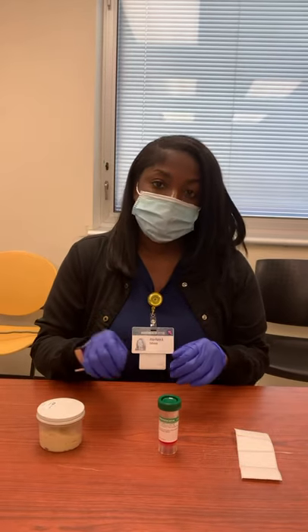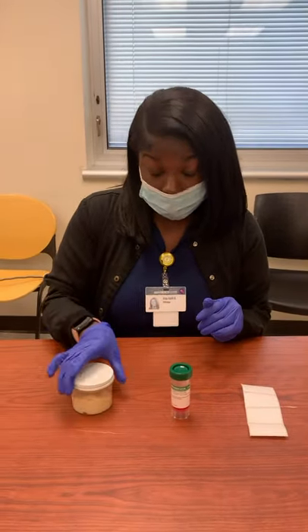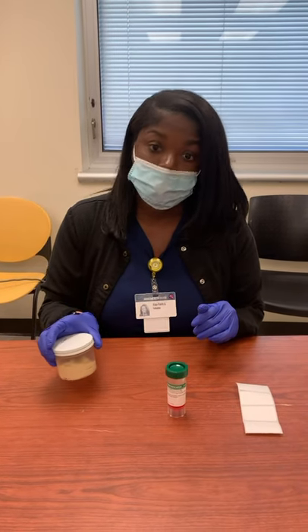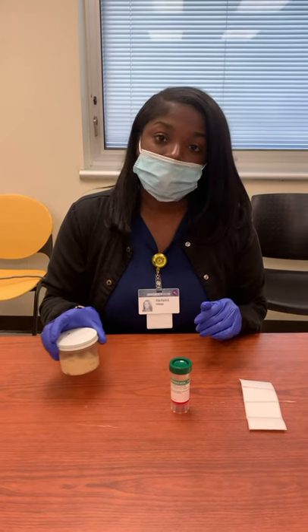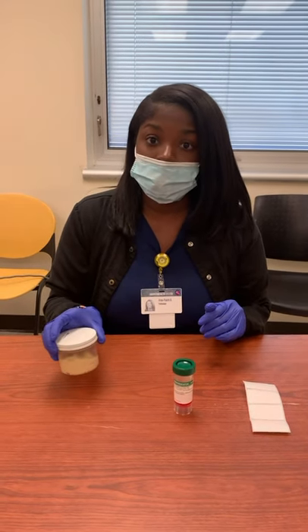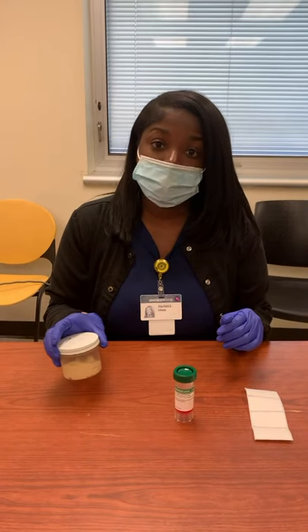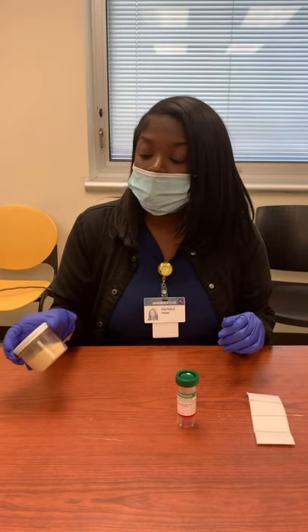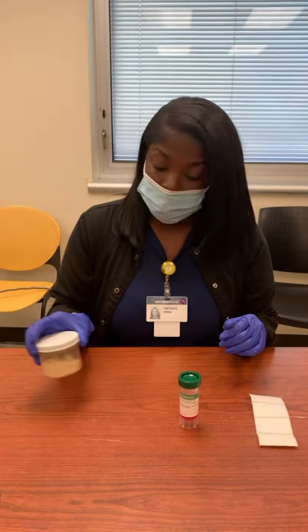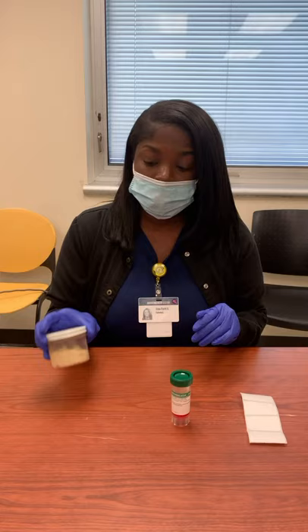I'm going to show you how we transfer it over. We want to collect the stool inside of the sterile container first, and then we want to make sure that the stool doesn't contain any urine or any water. That's very important because when you send it to molecular, we want to make sure there's no contamination inside the container. Once you see that the stool is soft and not too formed, then you're good to go.